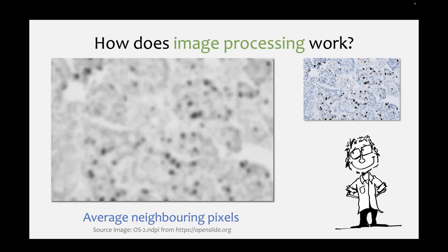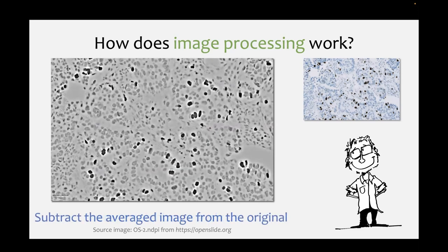This is an example of image processing because an image goes in, you do something to it, and an image comes out the other end. In this case, all we did was average - just additions and multiplications, so it's simple arithmetic - but it's fundamentally transformed the image. Having done that, what if we were to then subtract that image from the one we had before? Again, it's just arithmetic, but we subtract the corresponding pixel values.